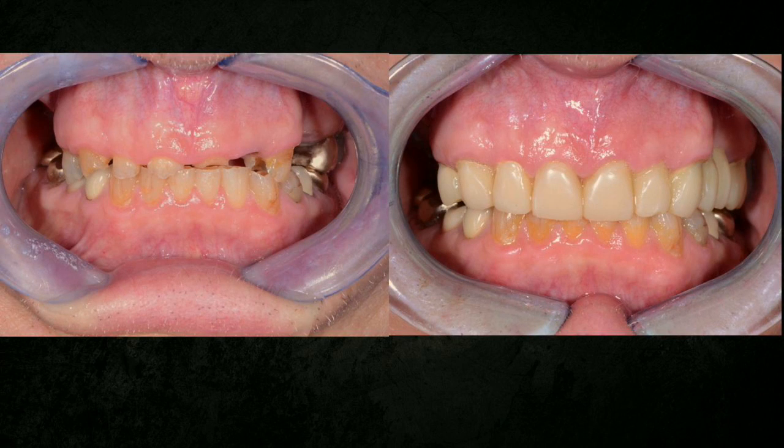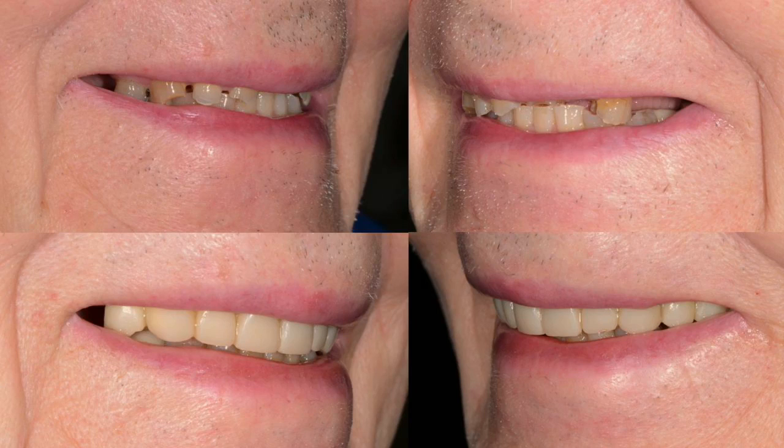There's the provisional in his mouth of the new vertical. Tu mamy w nowym wymiarze pionowym zwarcia korony tymczasowe. You could see the change in his face shape with just about 2.5 millimeters at the pin. Proszę zobaczyć, jaka jest zmiana wyglądu jego twarzy. Jest to na pinie siecznym, była to tylko różnica 2-3 mm.